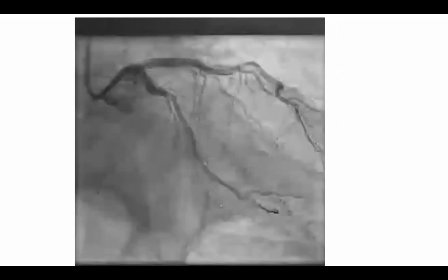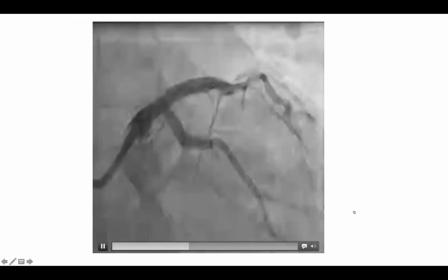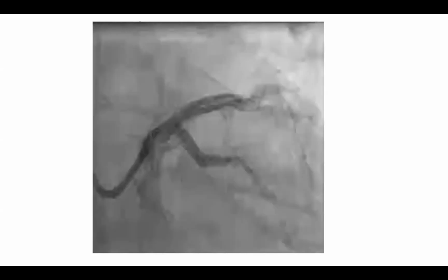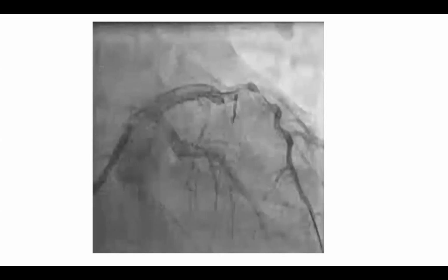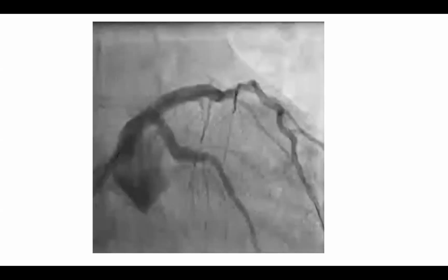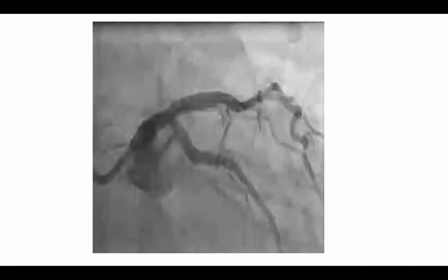I think one important thing is never go high pressure with 2 balloons. I would slightly undersize the balloons, because you are adding up where they're kissing in the left main. Here you are actually trying to reshape the geometry of the carina rather than getting the stent opposing the stent to the wall. So I think even a low pressure kissing inflation will restore the geometry.